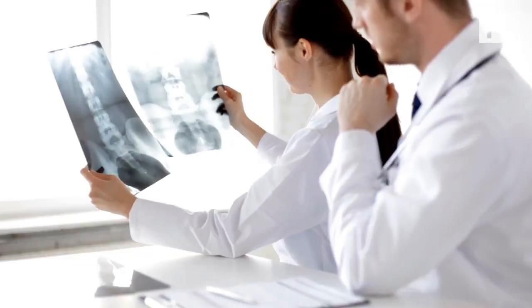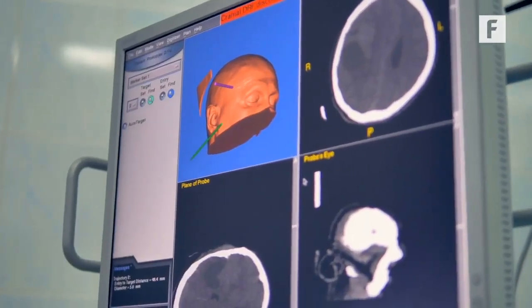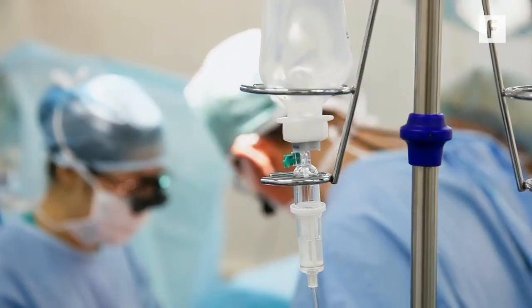Without technologies like this, we're still dependent on traditional black and white CT scans, which essentially only tell us where dense objects are in the body, like bones or other masses. Though this technology has only been used on a few segments of the human body, full scans are planned for the tech after more clinical trials.